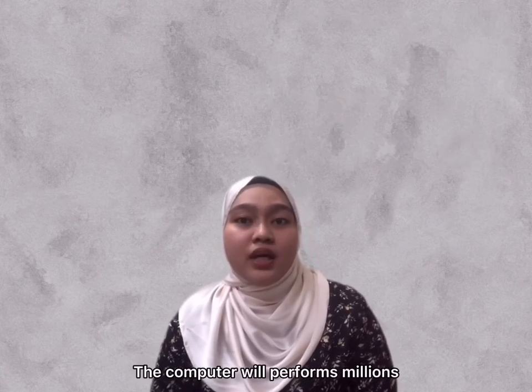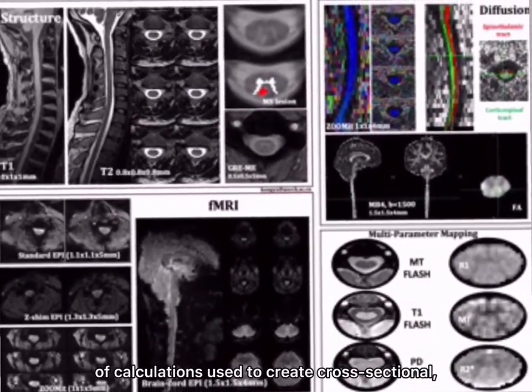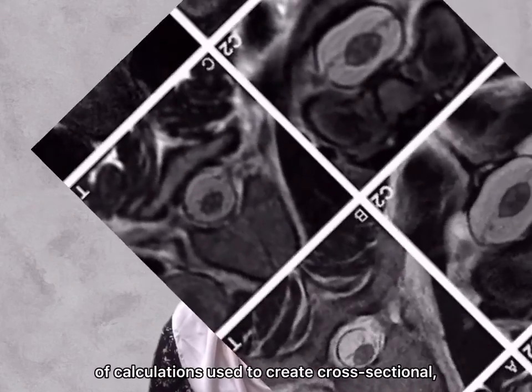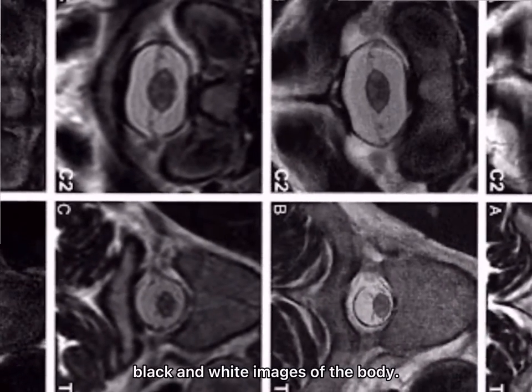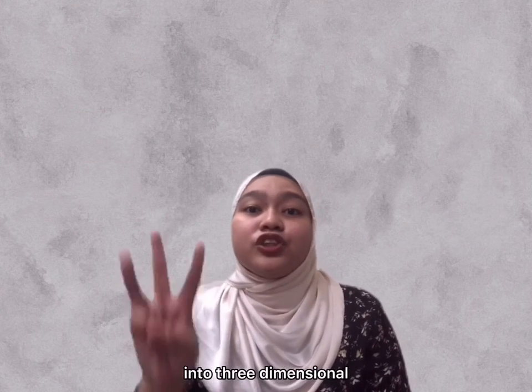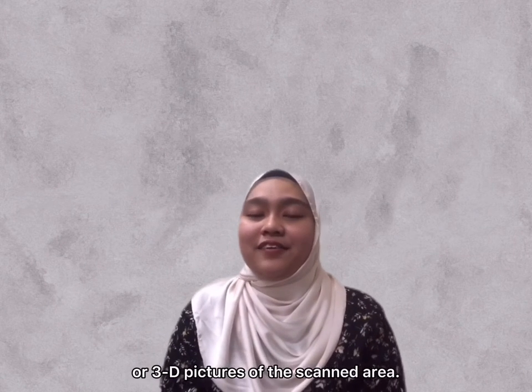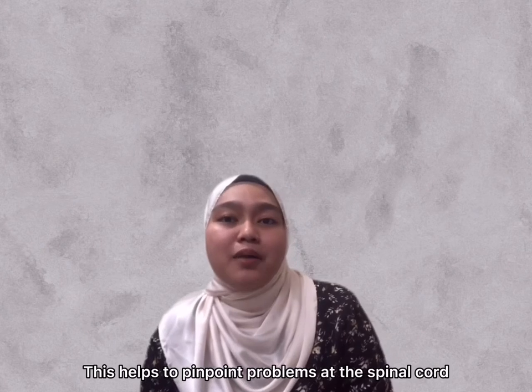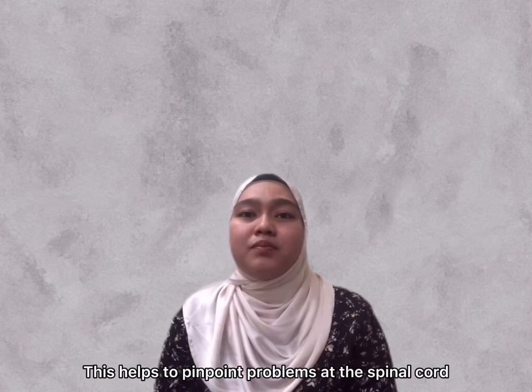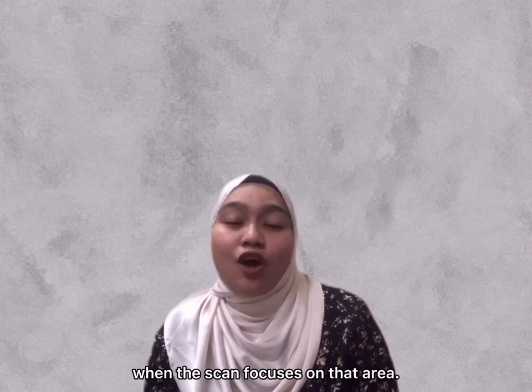The computer will perform millions of calculations used to create cross-sectional black and white images of the body. These images can be reconstructed into three-dimensional or 3D pictures of the scan area. This helps to pinpoint problems at the spinal cord when the scan focuses on that area.